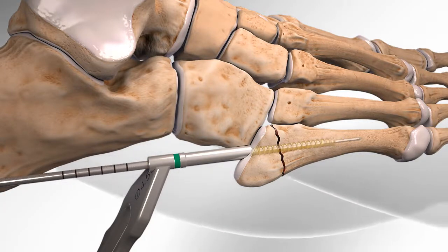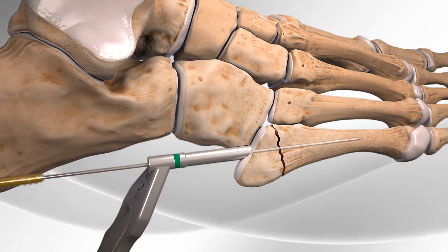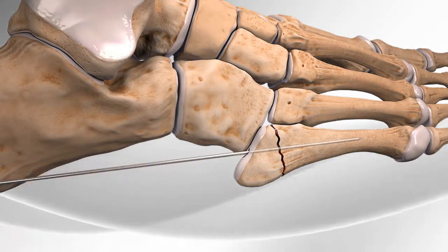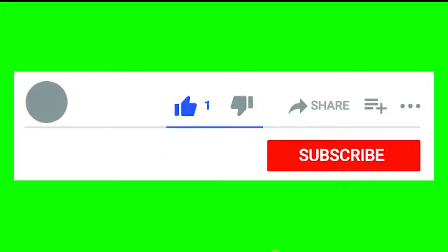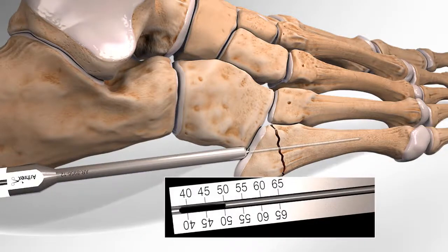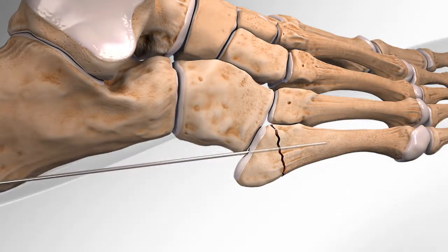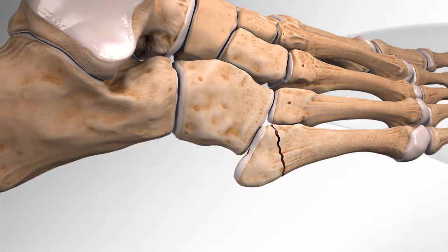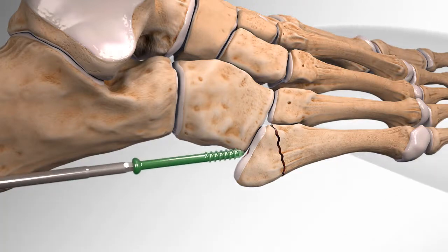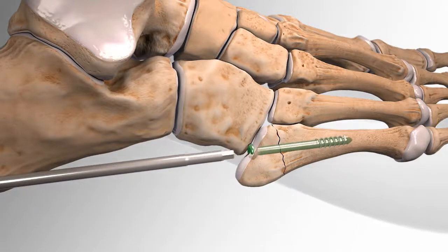The surgeon then taps to the desired length for placement of the surgical screw and measures the screw length. Lastly, the surgeon inserts the surgical screw through the base of the bone until it is fully inside the bone, holding the broken bones in place, completing the procedure.